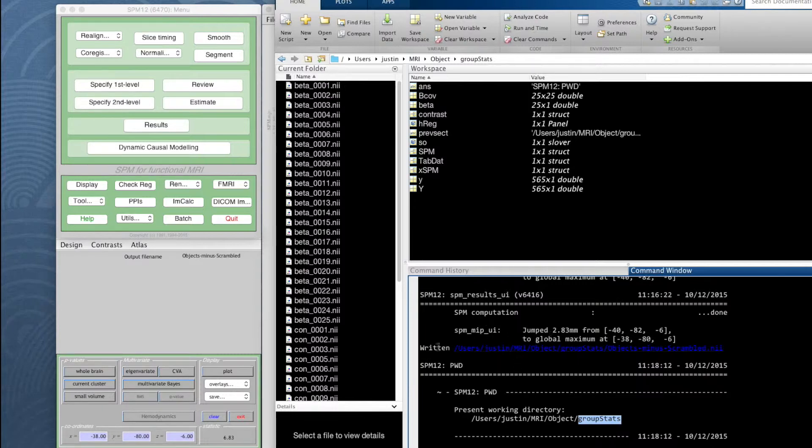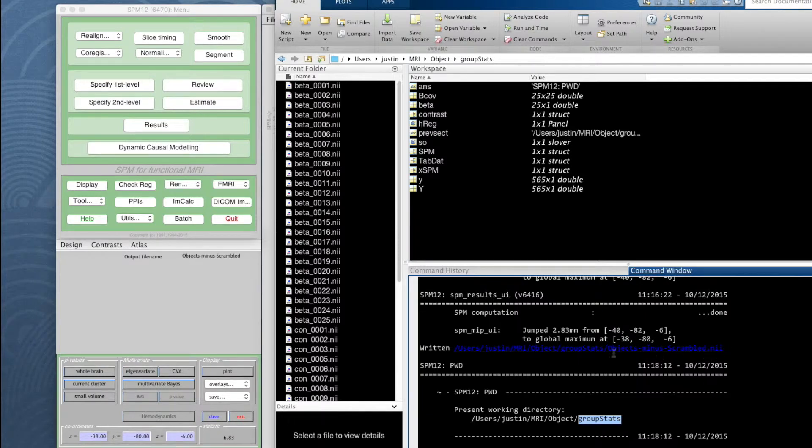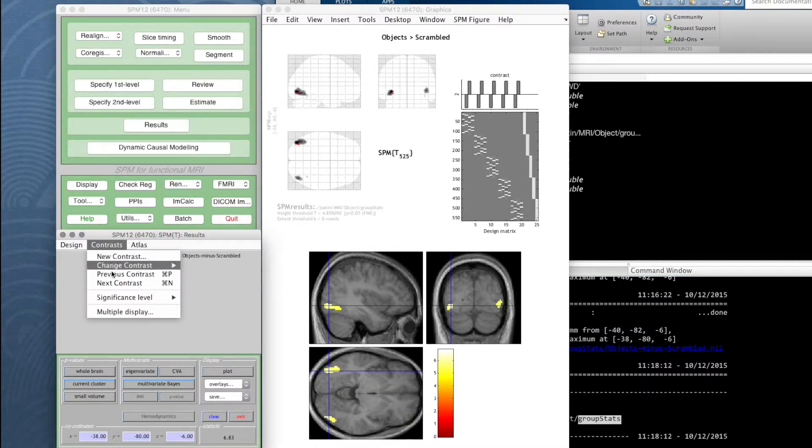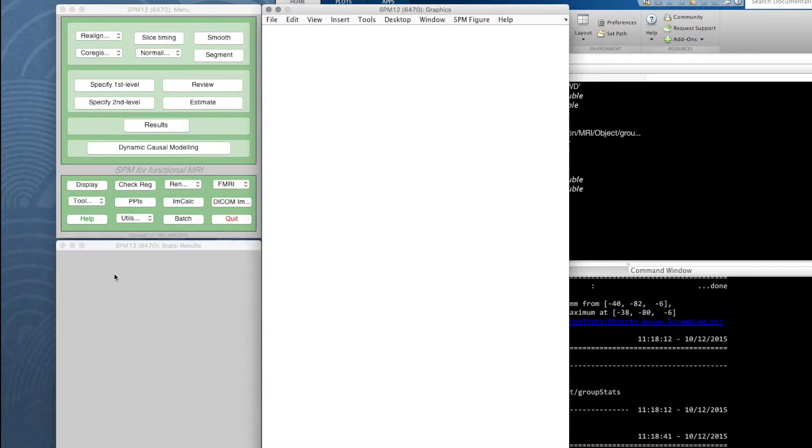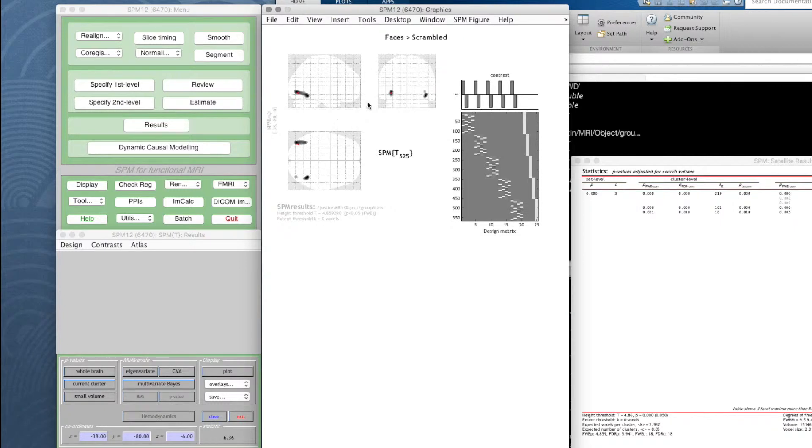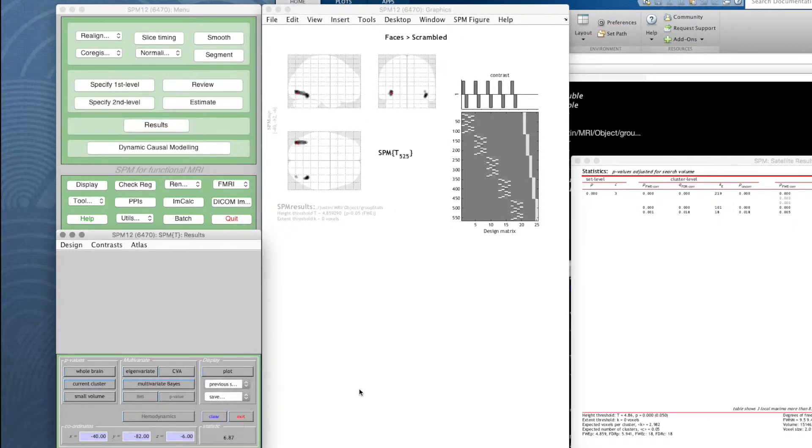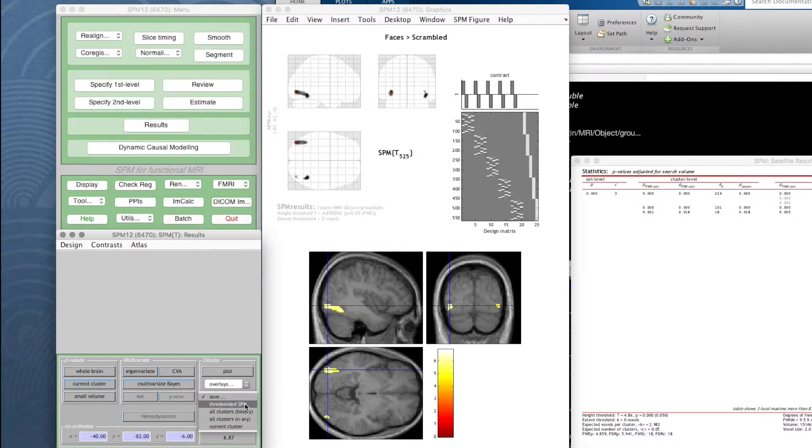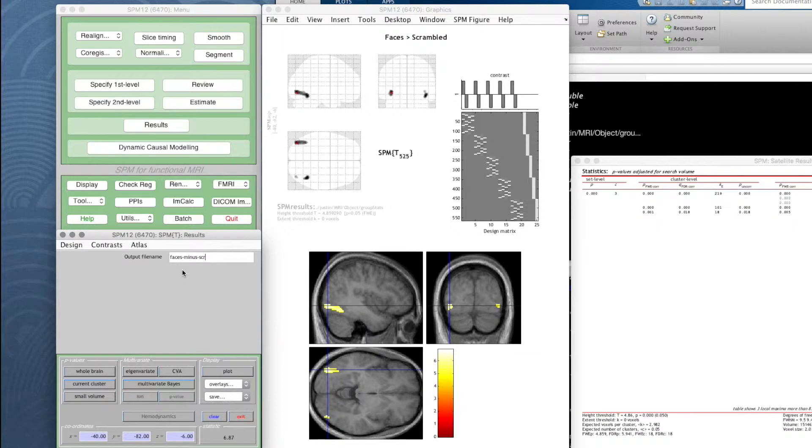So now if we go back to our previous contrast which was faces minus scrambled, let's go to global max there, let's have a look, check that looks okay. Let's now save that as well, the thresholded SPM. Just call it faces minus scrambled.